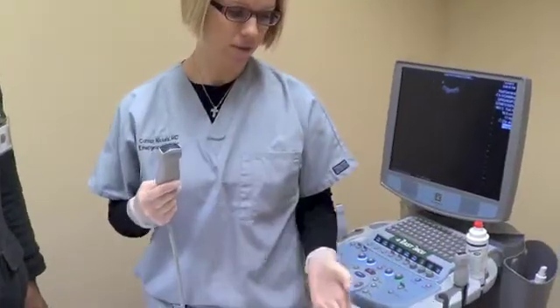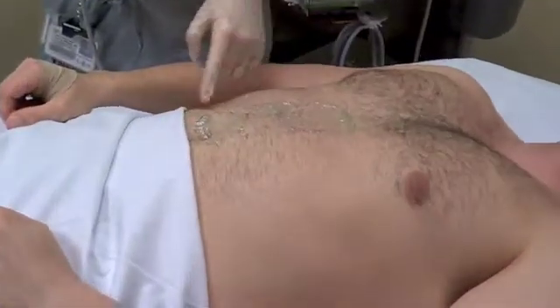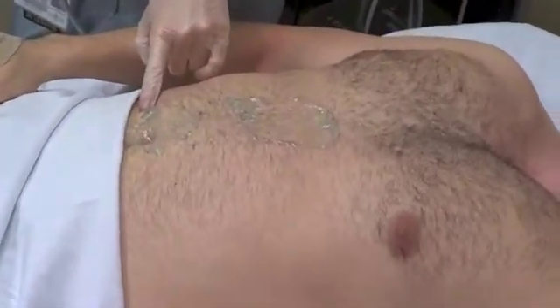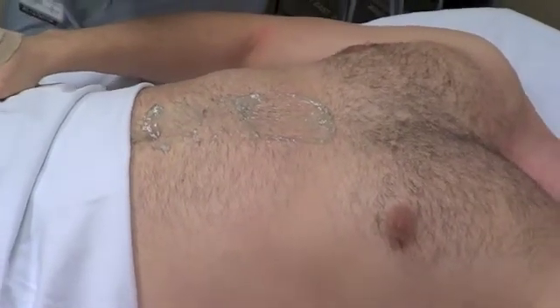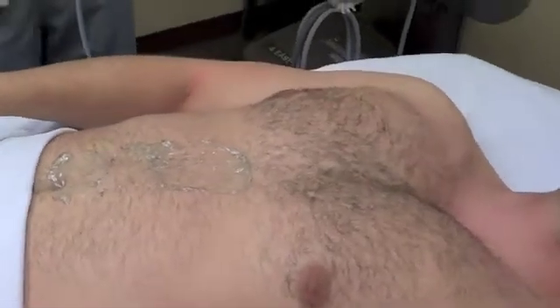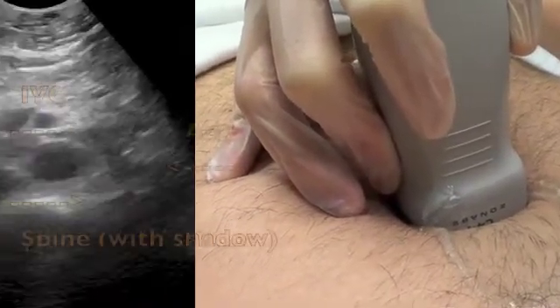We're going to be scanning from the sub-xiphoid area to the umbilicus, which is about where the patient will have their bifurcation. We do sagittal and transverse images. We typically start out in transverse because it gives us the best landmark, which is the spine. Our indicator is going to be towards the patient's right, and we're going to be in the abdominal preset.